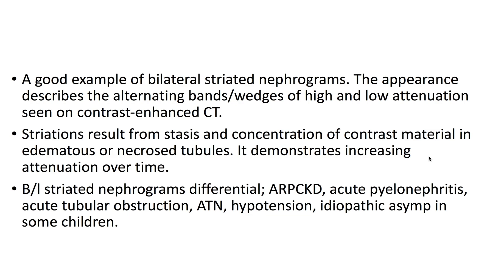This is a good example of bilateral striated nephrograms. The appearance describes the alternating bands or wedges of high and low attenuation seen on contrast-enhanced CT. The striations result from stasis and concentration of contrast material in edematous or necrosed tubules, demonstrating increasing attenuation over time.